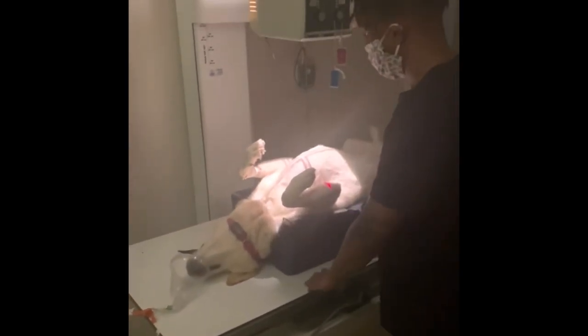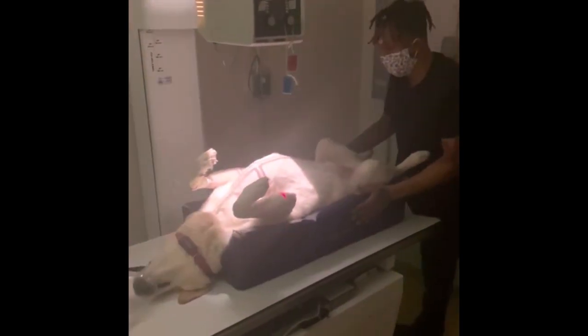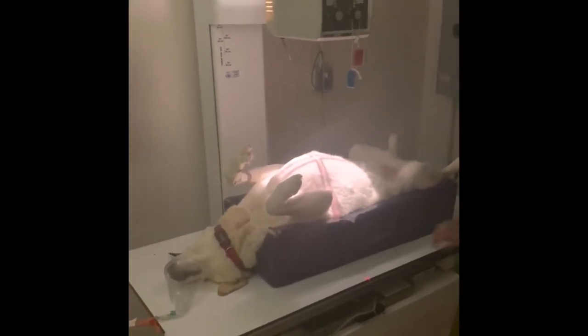Next, I'm going to measure the highest point of the dog's body that's going to be in the x-ray to make sure that it gets the right amount of exposure. The first x-ray I'm doing is the ventral dorsal image, where the dog lies on his back on a V-shaped trough to help keep him in place, with his body straight and his head in between his forelimbs, or his front legs.